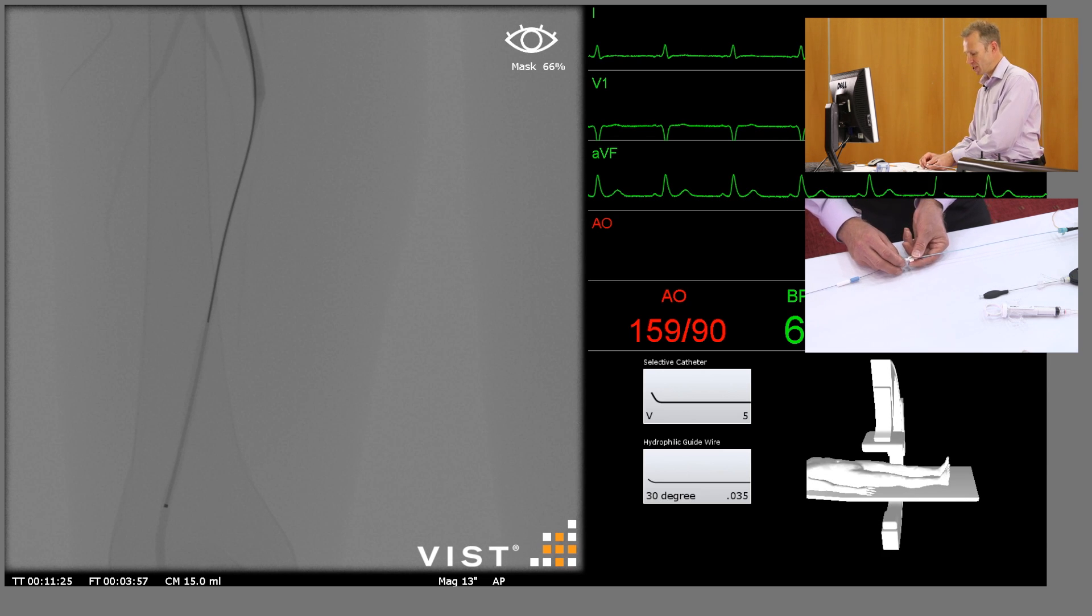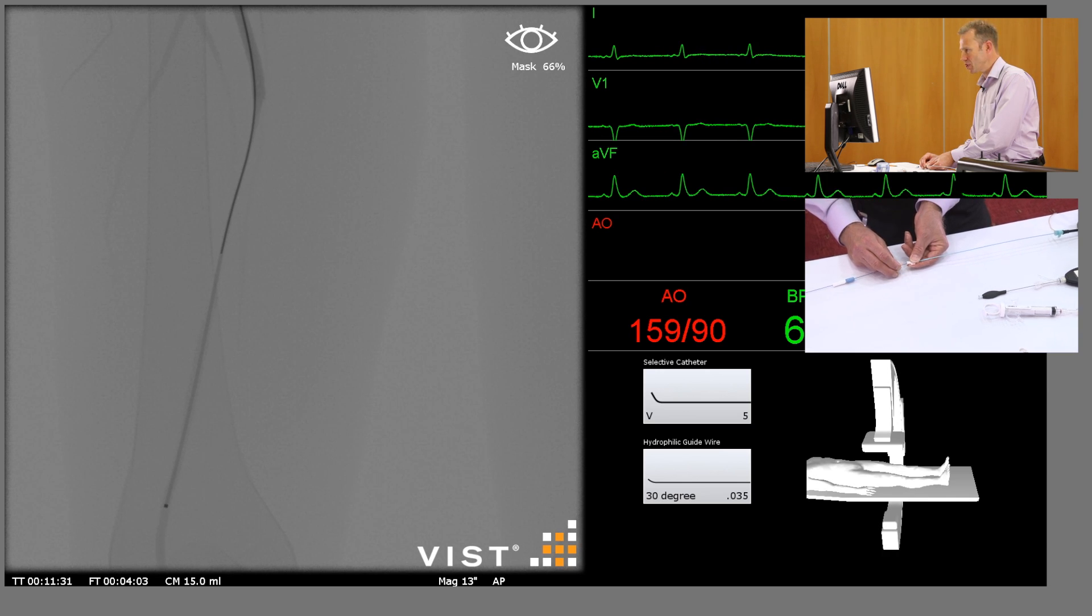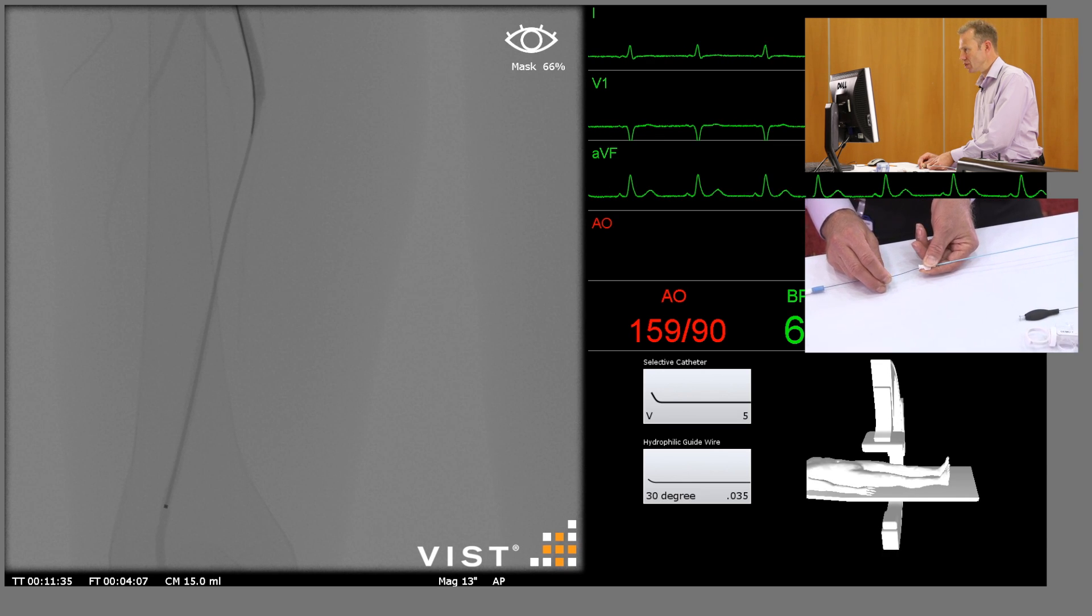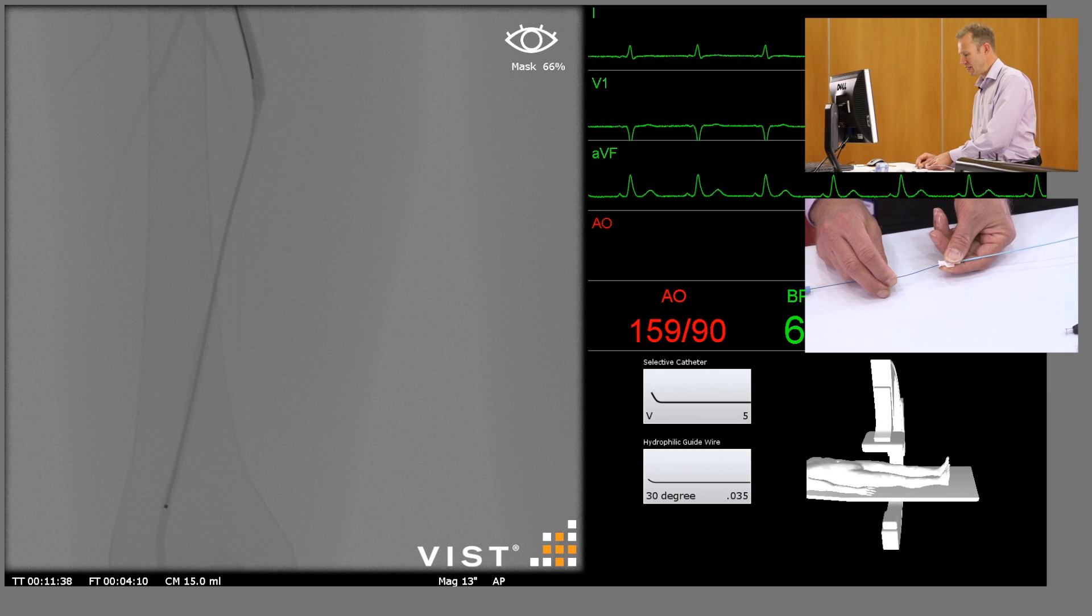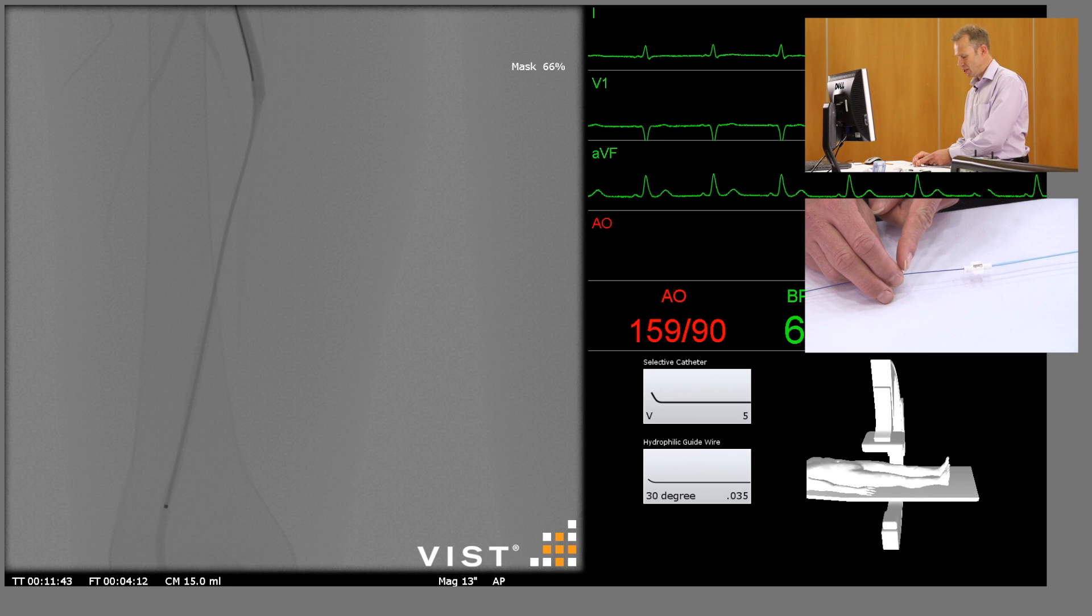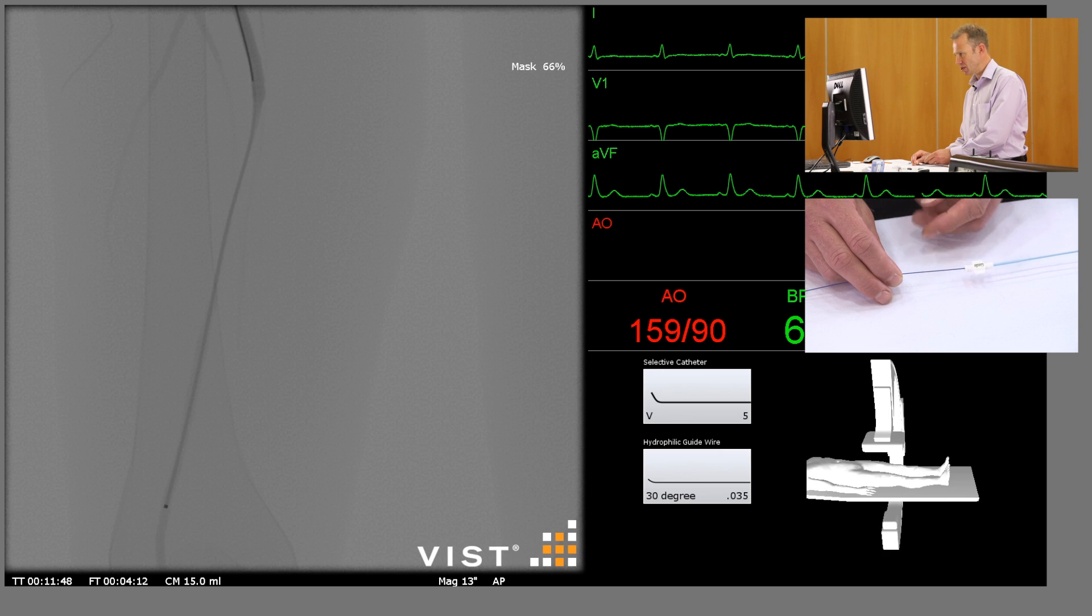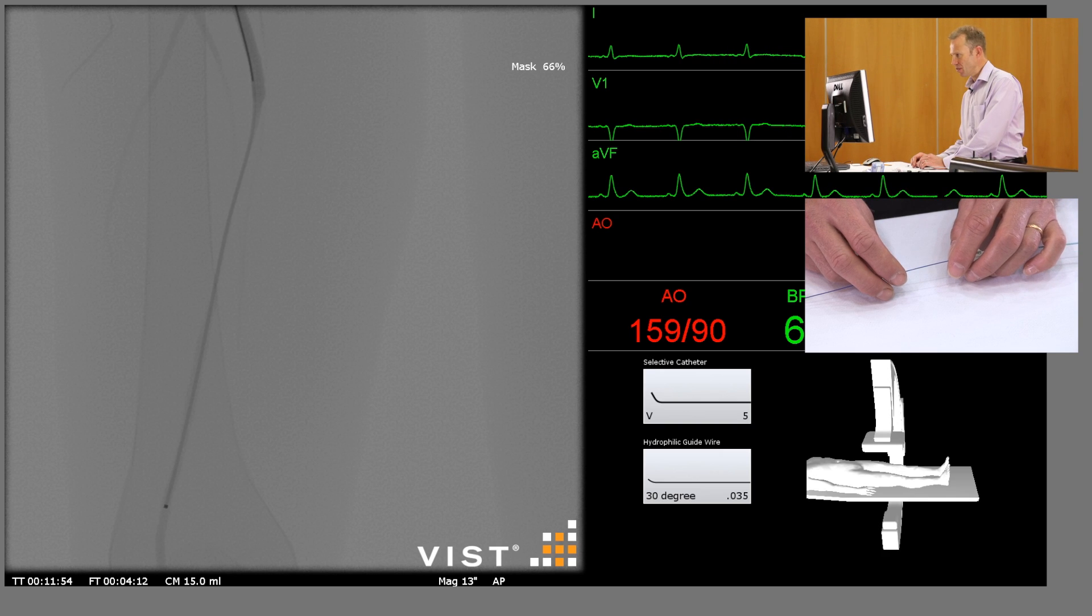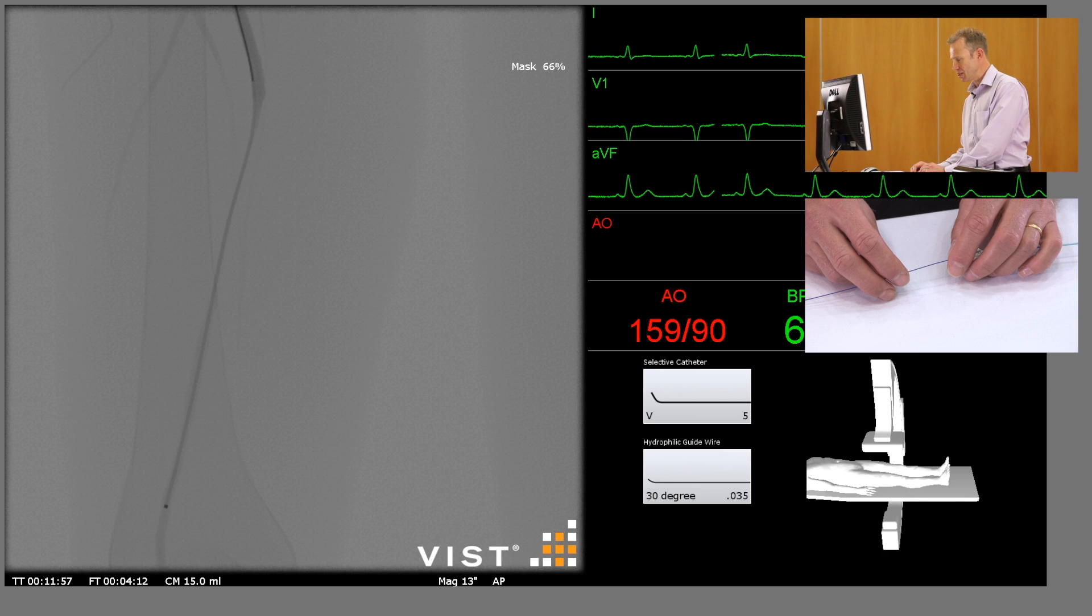I'm now going to fix my hands on the guide wire and I'm going to slowly pull the guide wire back whilst watching on the fluoroscopy. When I've got back to the beginning of the lesion into normal vessel, that's there. Now I know that the distance and the length of the stent or balloon is between there and there, and I could take a centimeter sterile ruler and measure that distance. Because we're using a simulator here, that's not actually an accurate distance, and the length of the stenosis here is probably nearer 10 to 15 centimeters.